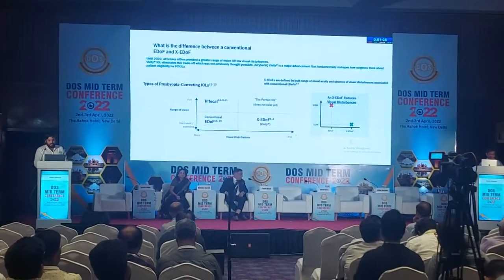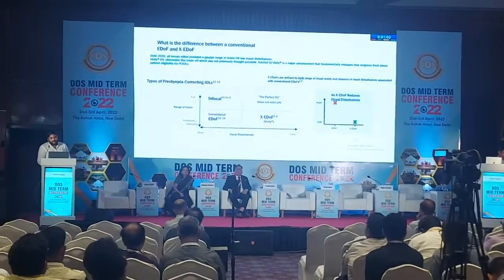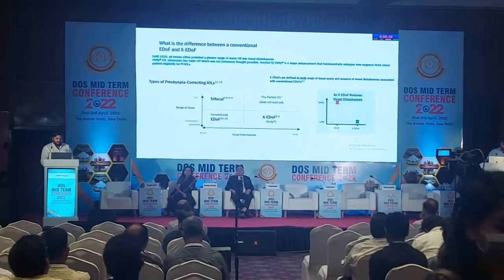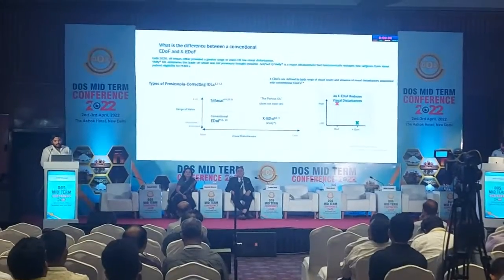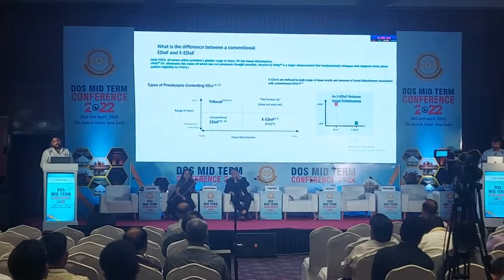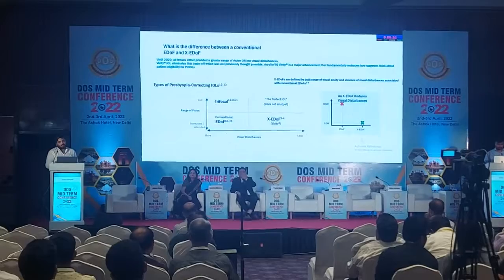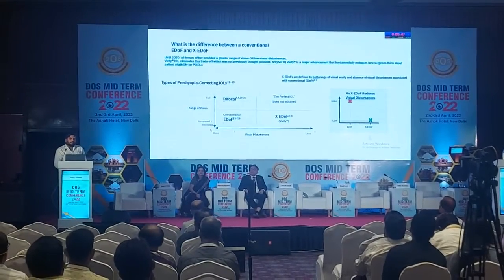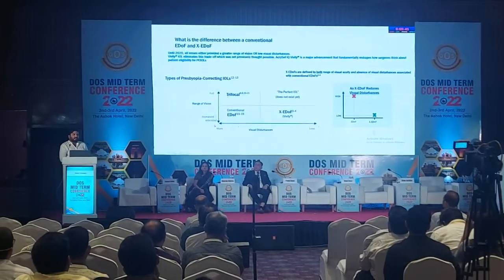So what is the difference between a conventional EDOF and Vivity, which is the new EDOF? Basically, conventional EDOFs were giving a lesser range of vision, as well as having more aberrations and more dysphotopsia, because they were based on a diffractive platform.